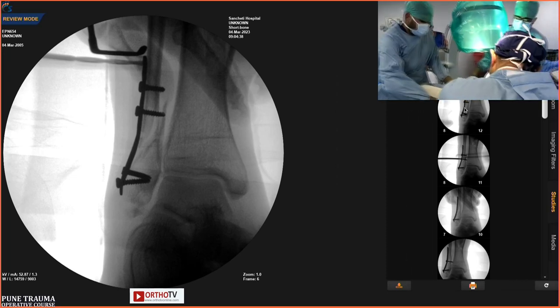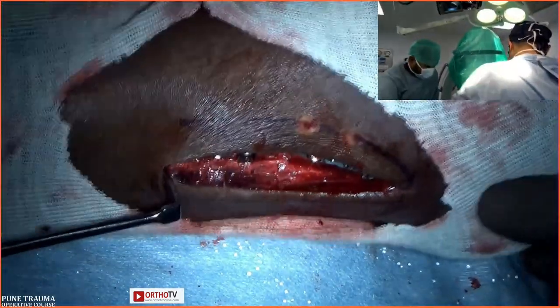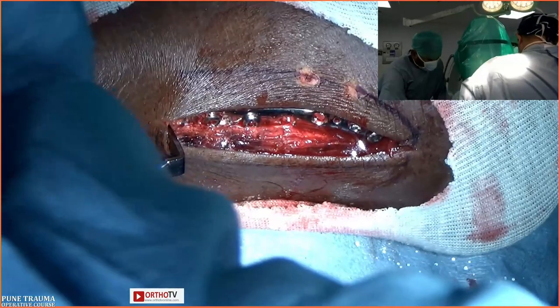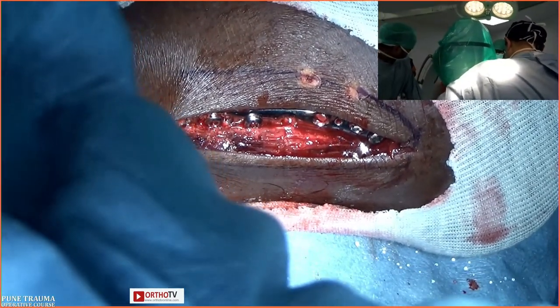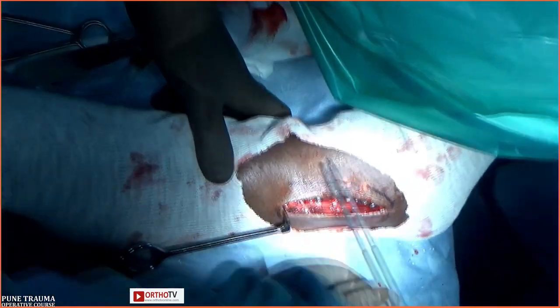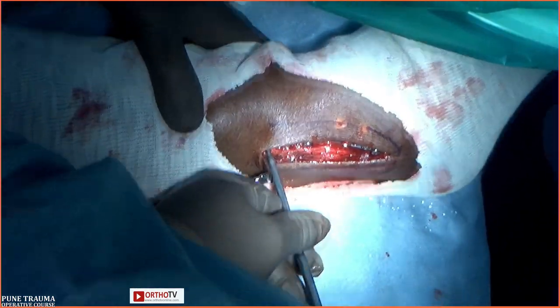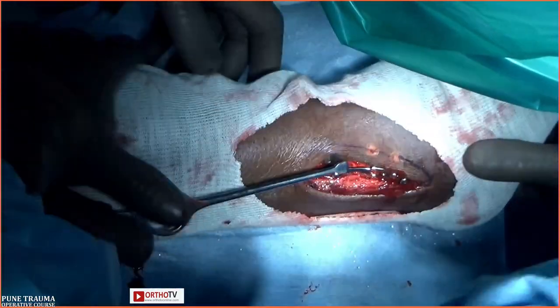So the bottom line is, Chetan, spiral. Are you happy with your fibular reduction and fixation? So if it is more spiral and non-comminuted, fix the fibula first. If comminuted, just pull it out to length, restore the height of the fibula, do the tibia nailing, and then the definitive fixation of the fibula. Chetan, if you look at the ankle mortise, are you happy with that reduction of the fibula?